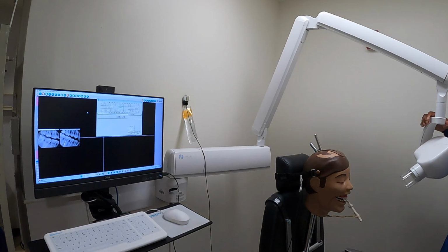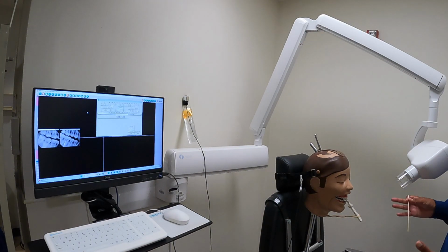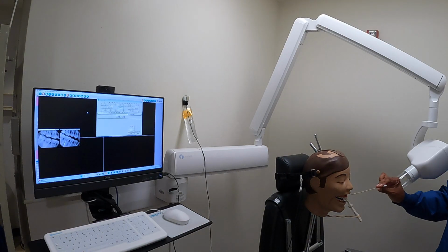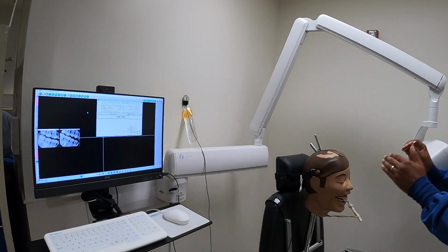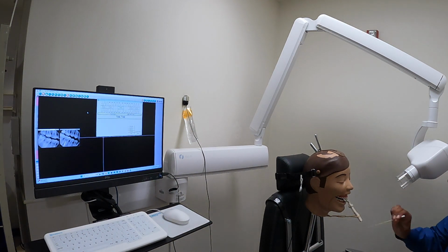And then I said that if you are doing your anteriors, you can basically look with your own bare eyes, and it's clear to see that if I was going to stand anywhere in this room to see between the interproximal spaces of those front teeth, this would be the direction I would want to go. It doesn't necessarily need to be exact, but it's this high. I can be this high and go right through there.